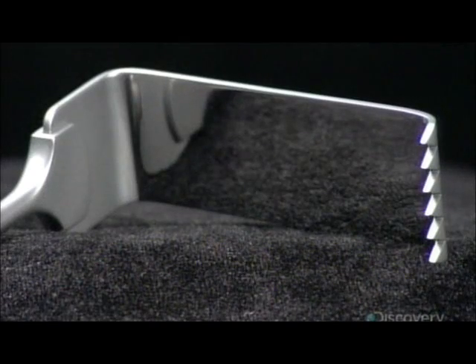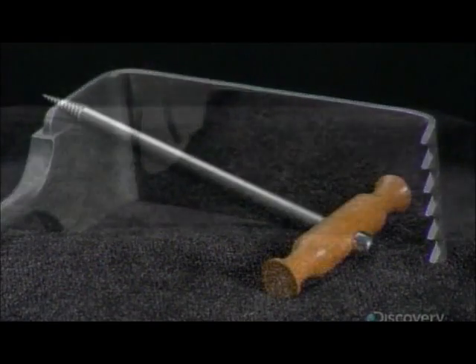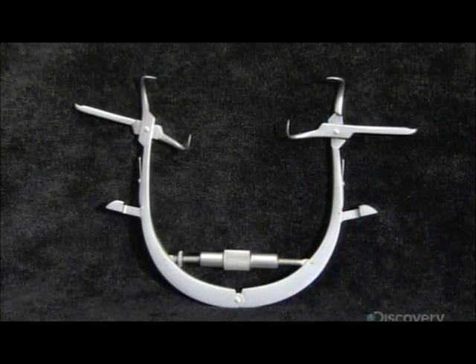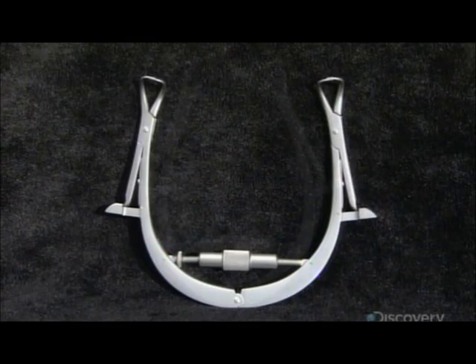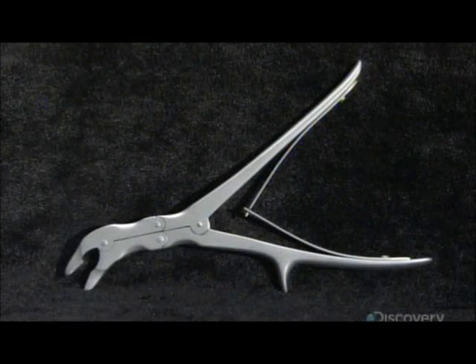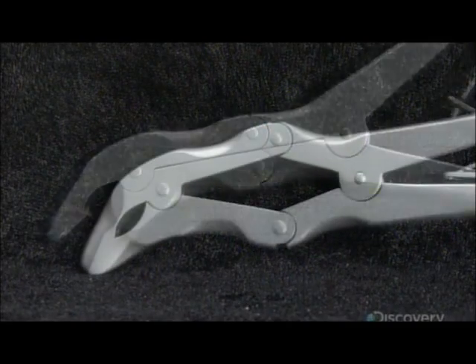In the hands of a skilled surgeon, the right tool can be a lifesaver. There are now hundreds to choose from, each designed for a specific task or operation. Made of surgical-grade steel, which is extremely corrosion-resistant, they can withstand frequent cleaning and sterilizing.